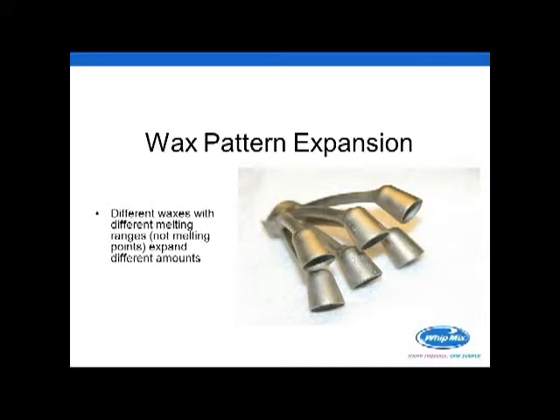What you can do, especially those of you who are in larger laboratories that may be experiencing some problematic things with expansion, go ahead and get every one of your waxers to wax you up a coping on a standard die using the wax they use. Now, some of you have standardized wax. That's good. If you don't, and many don't, because waxers are kind of unique and like to work with the properties that take care of stackability and carvability and crack resistance and that kind of thing, you'll have multiple waxers with multiple waxes. Have them all create a coping on the same die. Then sprue all of those copings up and invest them in the same ring. Then burn them out and cast them out of an alloy.